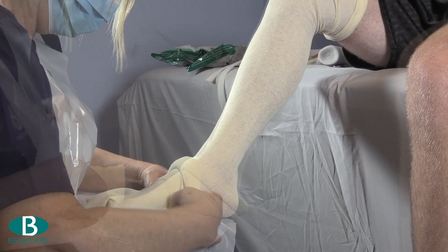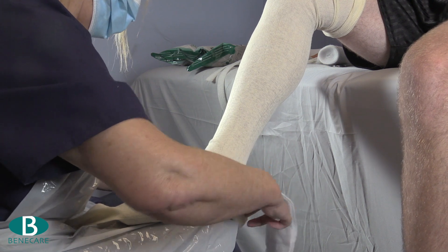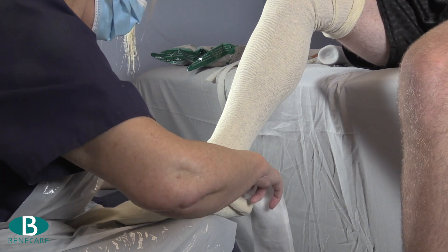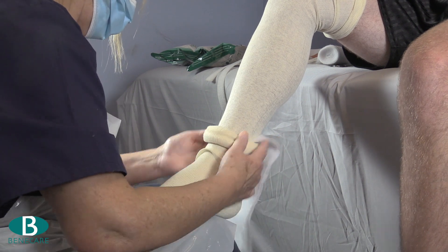Now apply the second layer of stockinette as you did with the first layer, smoothing the padding along the posterior aspect of the leg as you go. Ensure the stockinette is well fitted and wrinkle free.